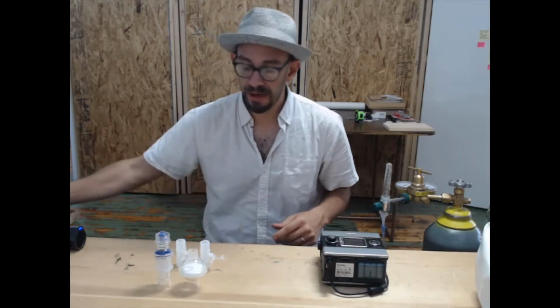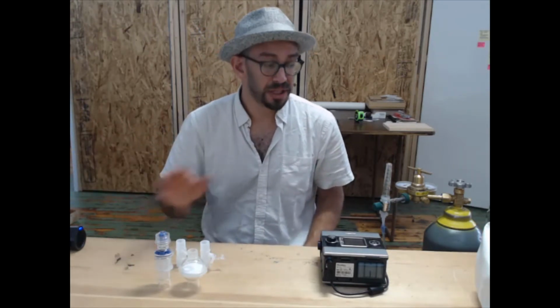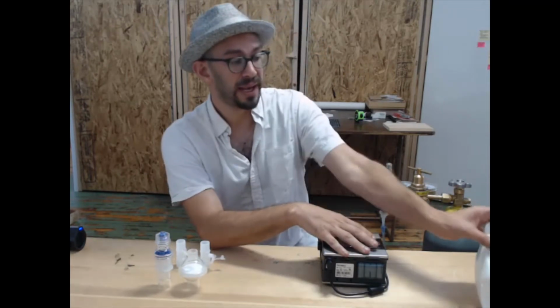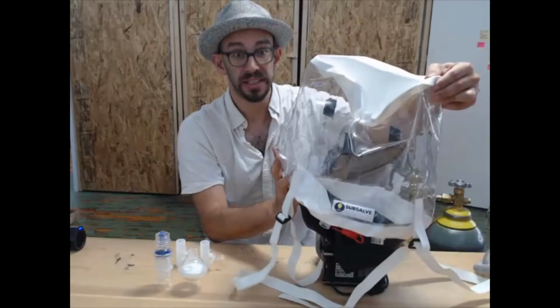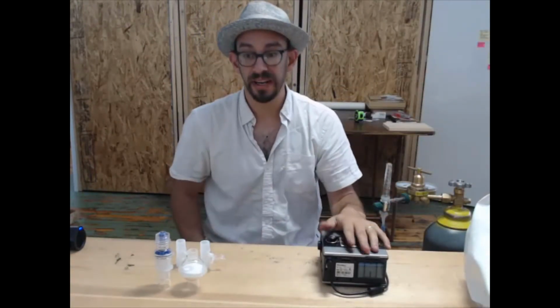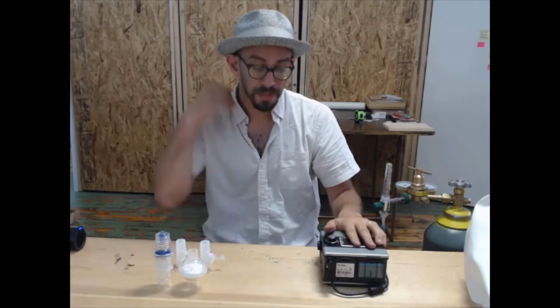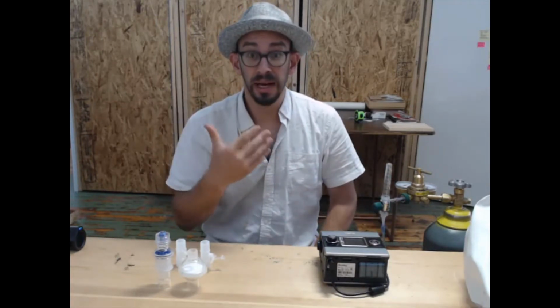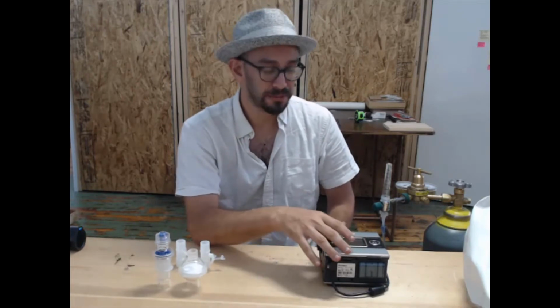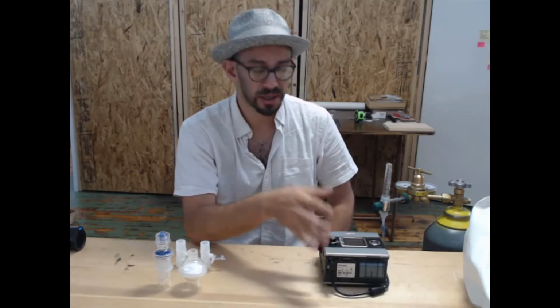Let's start with assembling the circuit. So you're going to see two key parts to it. There is a CPAP and the oxygen treatment hood itself. CPAP is going to provide pressurized air going through. We provide different models of CPAPs. These are all donated CPAPs, and we provide different models with our circuits.